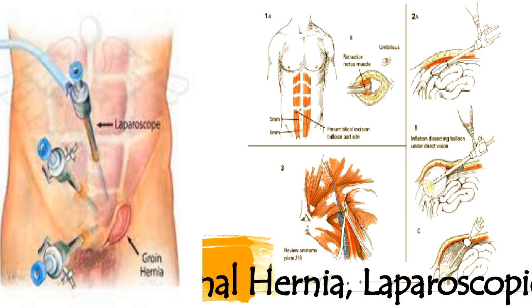The balloon is desufflated and removed. The smaller stay balloon is then inserted, figure 2c, and filled with 40 ml of air. It is used to hold traction on the fascia by being retracted back and locked. This is attached to the CO2 insufflator, which is set to a pressure of 15 mm of mercury. The patient is placed in a slight Trendelenburg position to avoid external compression of the preperitoneal space by the abdominal viscera. The hernia spaces are examined.